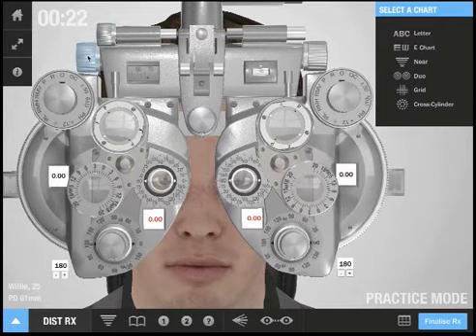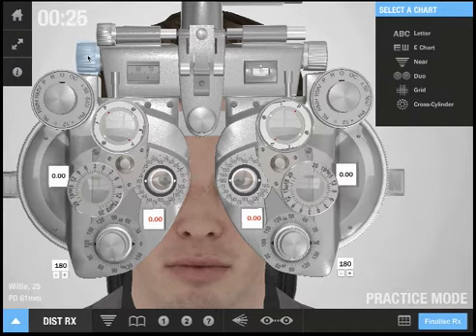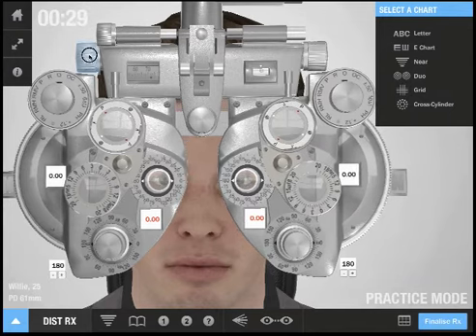Here I can adjust the PD. I know the patient's PD is 61 millimeters, so I will adjust it to that.